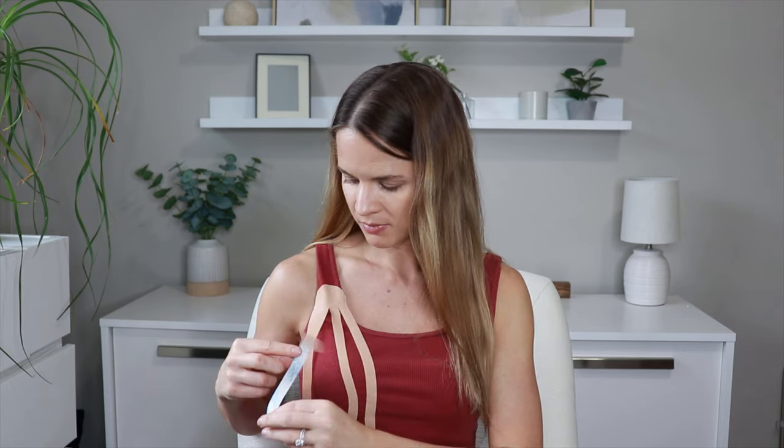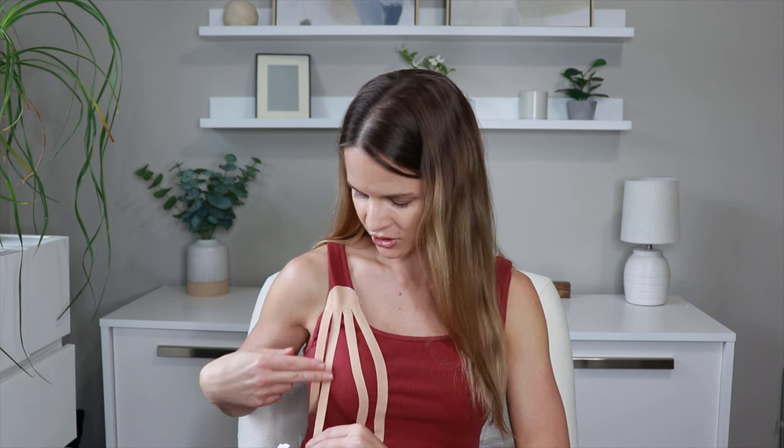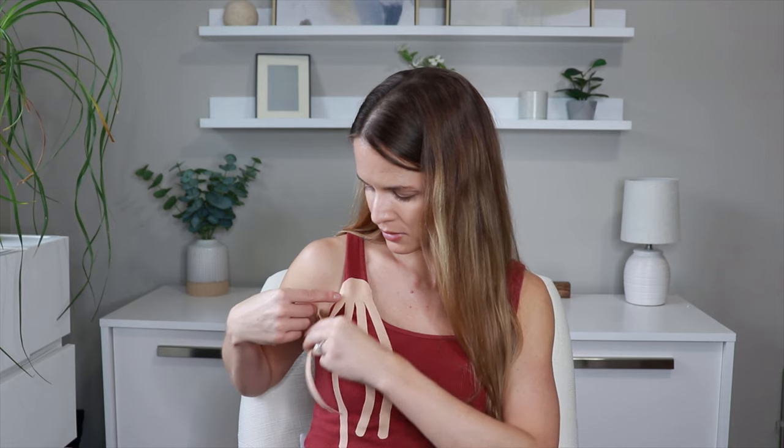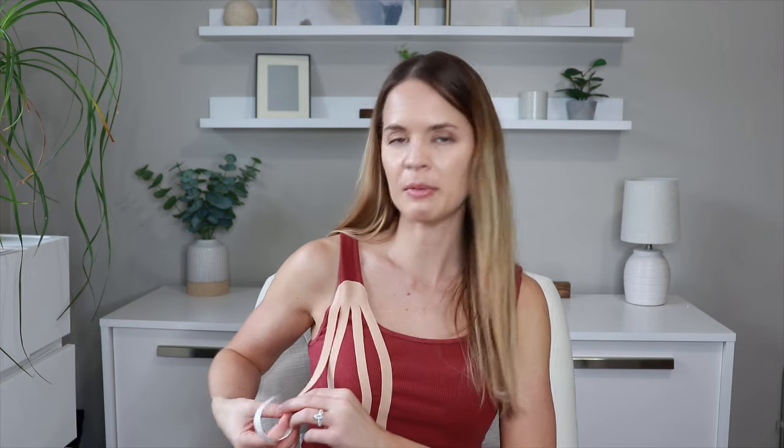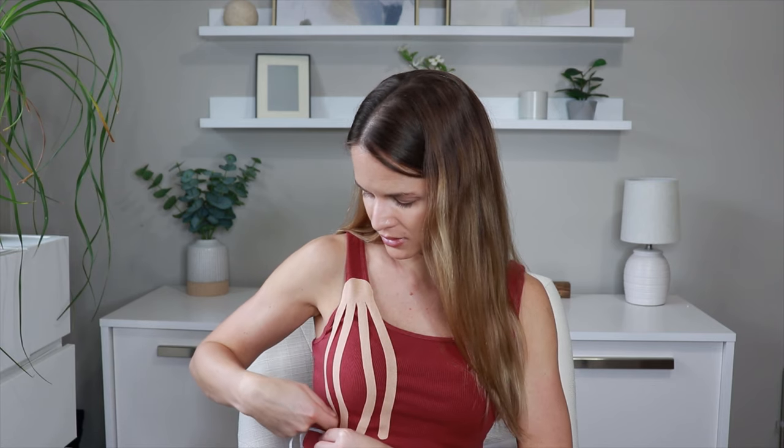Continue with the third strip: peel back, slight tension, and leave it down without tension at the end. Then the last one — a lot of people tend to hold swelling on the outer side, so come around and then leave that last little bit without tension. From there go through and rub the whole thing down to really activate the adhesive. That is a really basic general way to place kinesiology tape for a breast or chest that is swollen, for someone with a healthy lymphatic system without any lymphatic dysfunction.